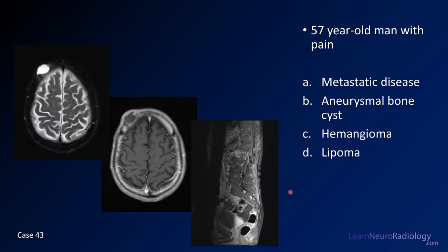Case number 43 is a 57-year-old man with pain. We have a couple of brain images — a T2 and a post-contrast — and an additional image of the spine, which may be a clue. Your choices are metastatic disease, aneurysmal bone cyst, hemangioma, or lipoma.